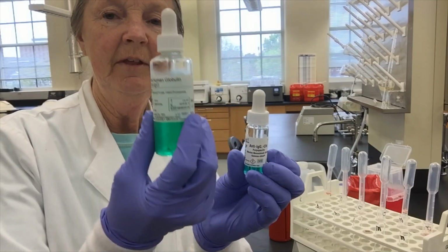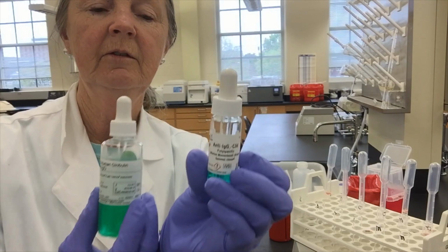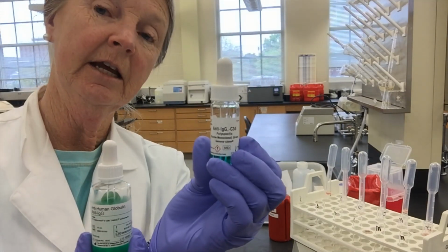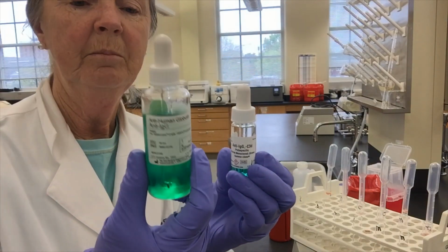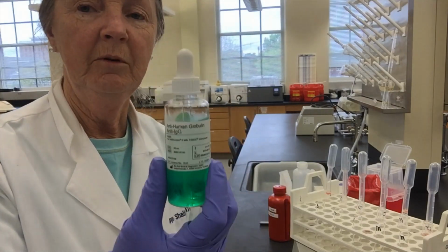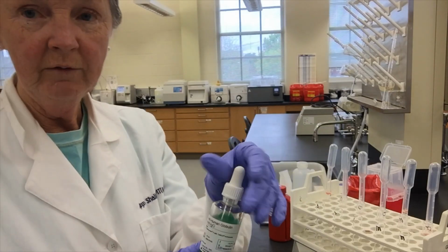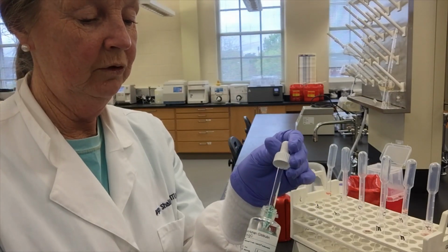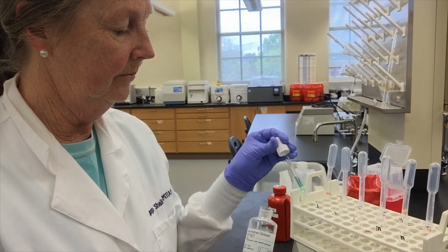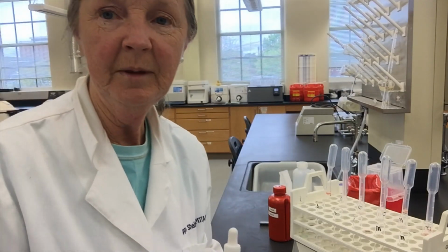They're basically the same thing. This one is just an anti-IgG. This is polyspecific, meaning that it has an anti-IgG and anti-complement. Because I'm really short on supplies, you can use either one, but for adults we could use the IgG specifically. And I have more of this and I'm thinking I might need the other when we do some of our antibody testing. So I'm going to put this in. I'm going to add 1 drop of cells and spin that.